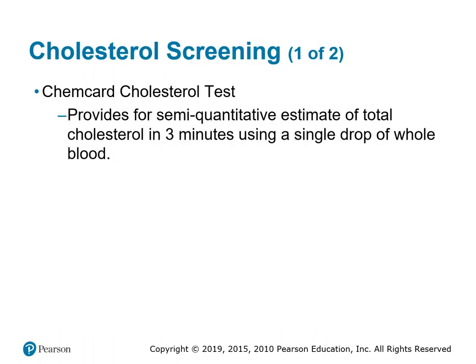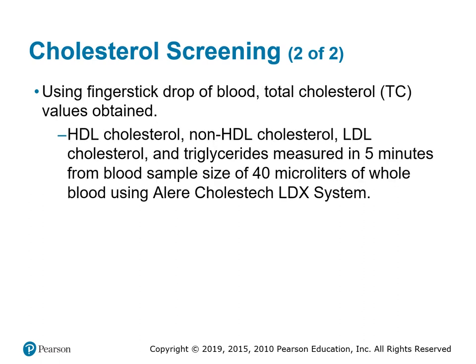So HemoQ, you know that already. The ChemCard cholesterol test provides semi-quantitative estimates of total cholesterol in 3 minutes using a single drop of whole blood from a finger stick. Total cholesterol, or TC, values obtained. HDL cholesterol and non-HDL cholesterol, LDL cholesterol and triglycerides are measured in 5 minutes from blood sample sizes of 40 microliters of whole blood using the Cholestech LDX system.